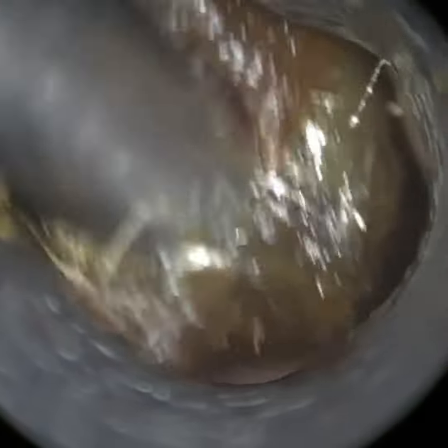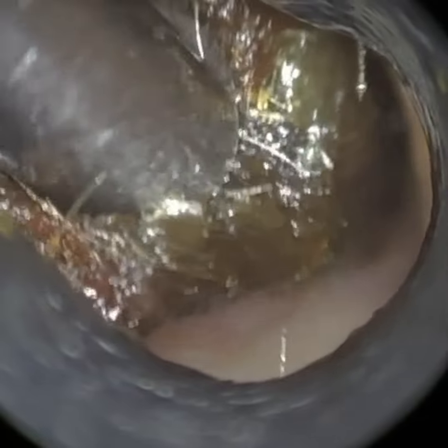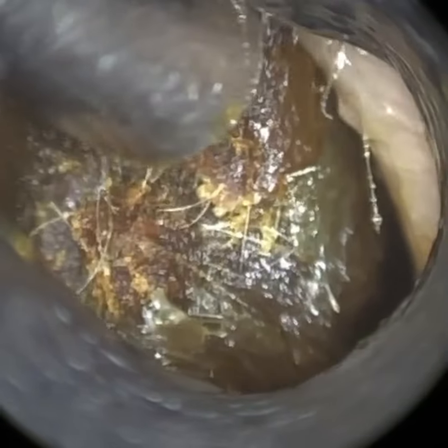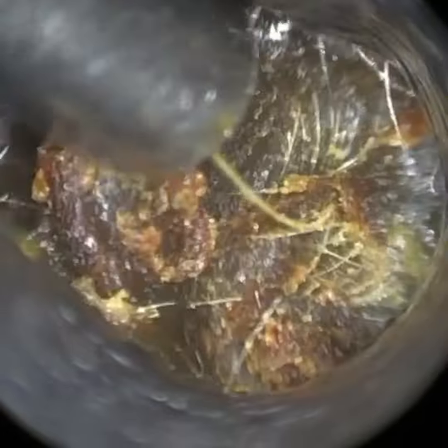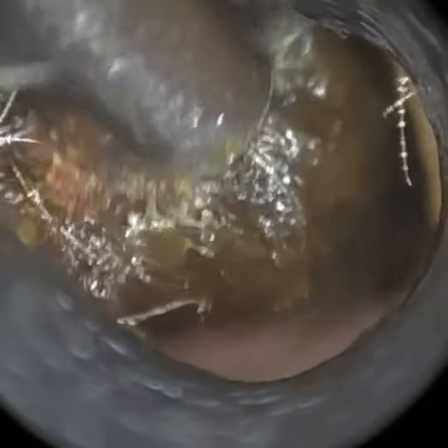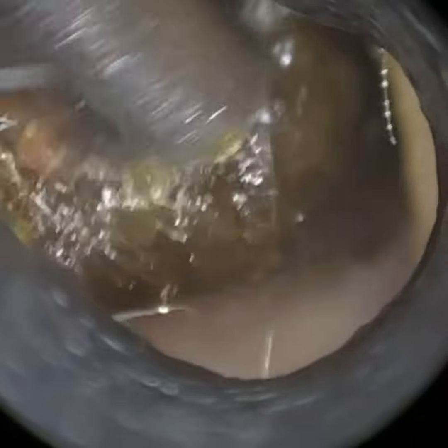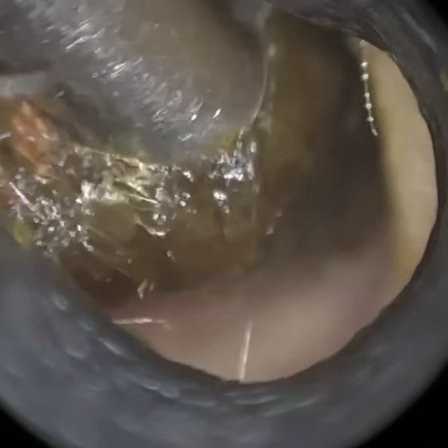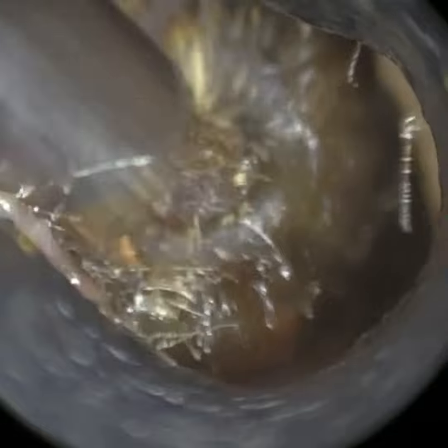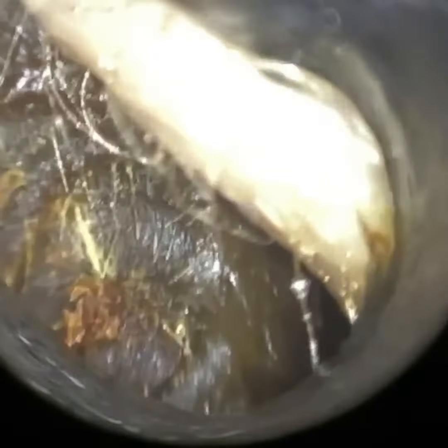Similar to the patient's right ear — I've just put some drops in there. I'm just trying to wriggle this and beginning to mobilise it, but it's quite a tussle. I'm going to have to use hooks. I'm going around, going back to the roof of the ear canal, then more central and back down, looking for a weak spot. Quite often with wax plugs, if you remove it inferiorly and wriggle up — because they can get trapped in the inferior recess — if you manipulate the wax plug up and away, it can release itself and come out.